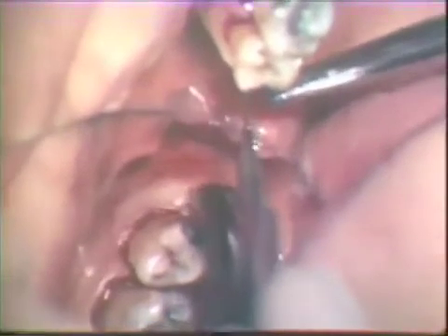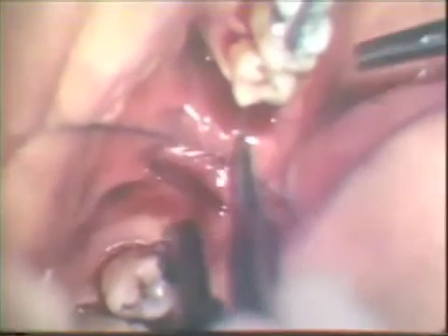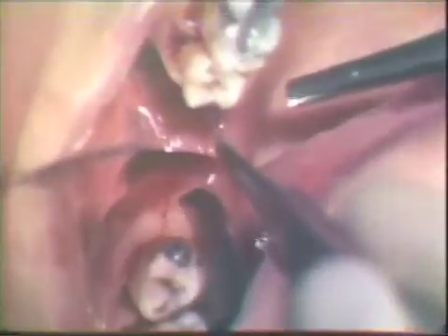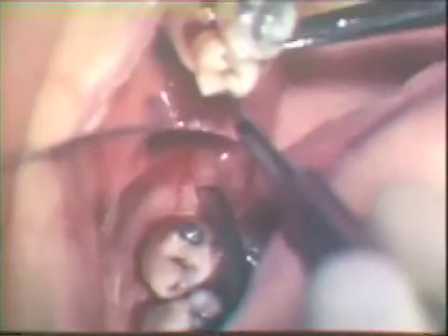An incision is then started from the distal buccal aspect of the last molar, carried down to the alveolar process, and extended distally towards the hamulus. A second distal incision is made about 3 millimeters away from the first. It is also carried down to the alveolar process and angled to contact the alveolar process close to the first incision. This will permit the removal of a wedge of fibrous tissue.